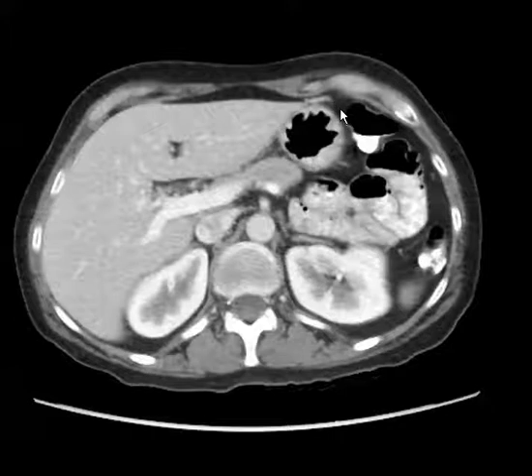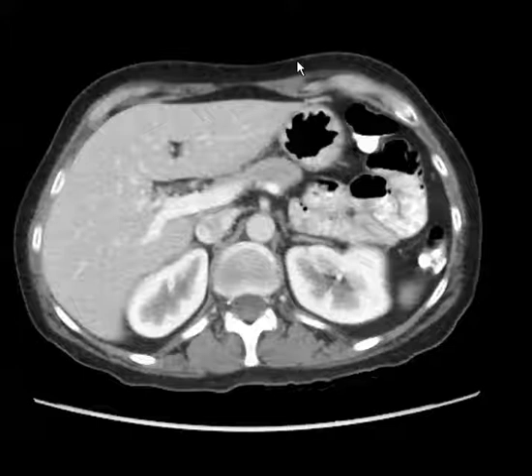These are axial CT images of the abdomen and pelvis after the use of intravenous and oral contrast in a 52-year-old female with right lower quadrant abdominal pain.